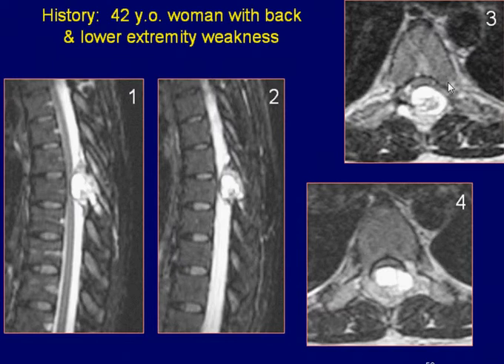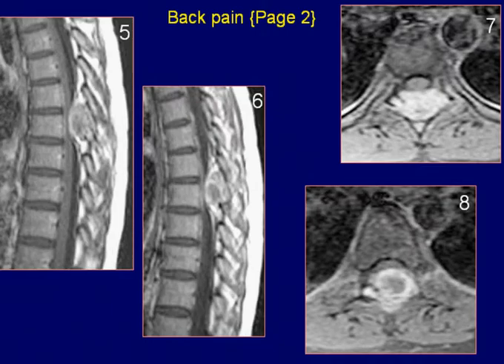Axial T2-weighted images show involvement of the posterior elements of the dorsal vertebra by the hypointense lesion. The spinal cord is markedly compressed by the lesion.